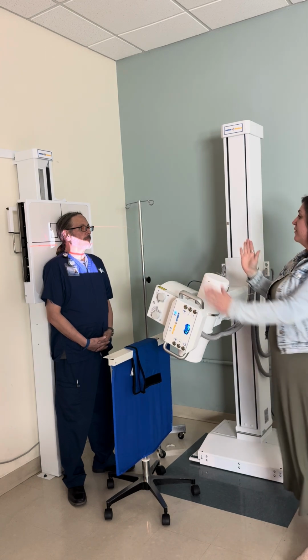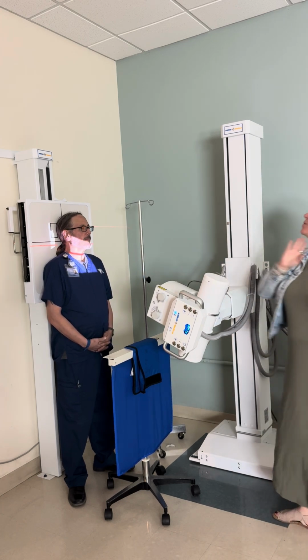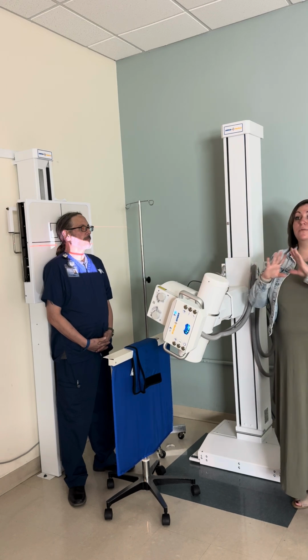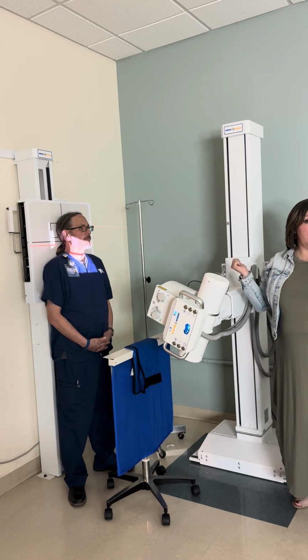I'm centered at C4. Come just a hair to the left, right? Right there. So we're in the midline, chin up, 15 degrees cephalad angle. That is my AP C-spine. We're just gonna have our patient hold their breath, okay? Don't breathe, don't move, and x-ray, okay?